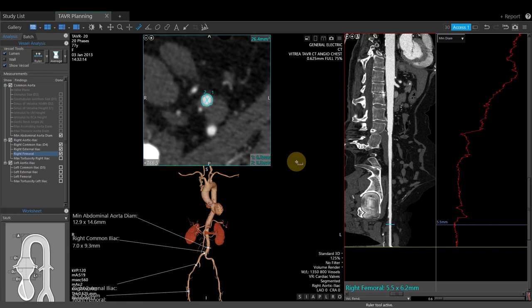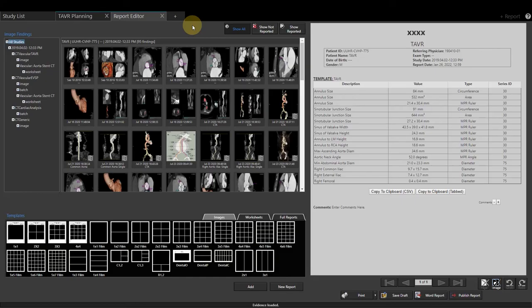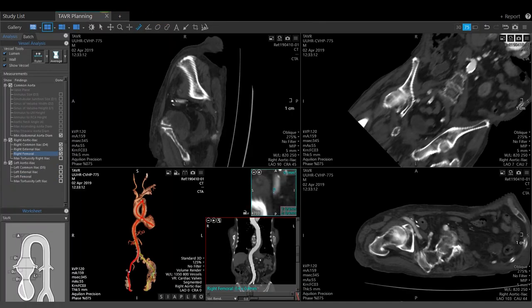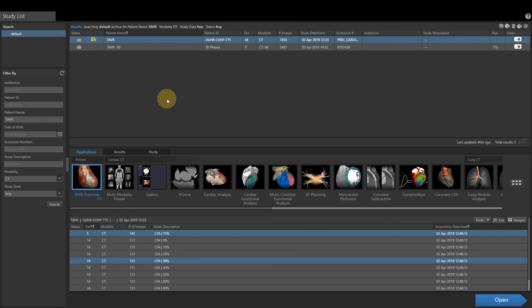Next, load the report by clicking the report button at the upper right-hand corner of the screen. Once the report editor is clicked, the TAVR report will generate and load. To publish this report and export to PACS, click the Publish Report button. Then close the report editor at the upper left, and close TAVR planning, which will return you back to the study list.